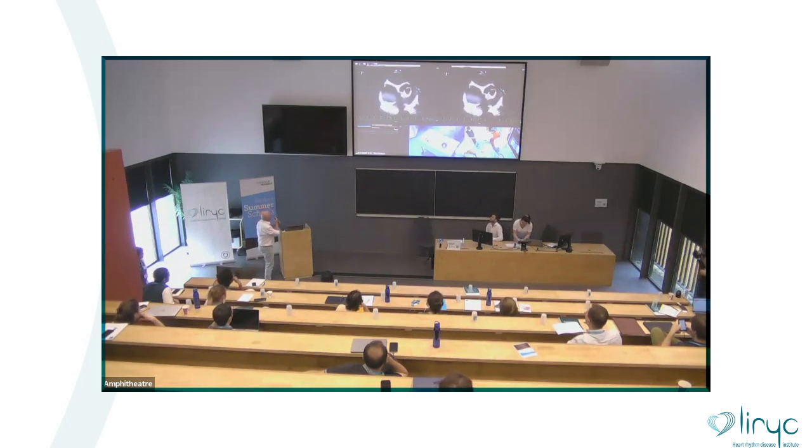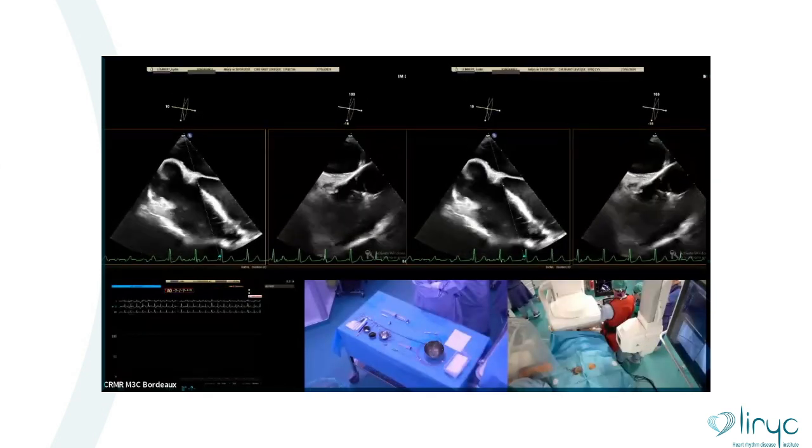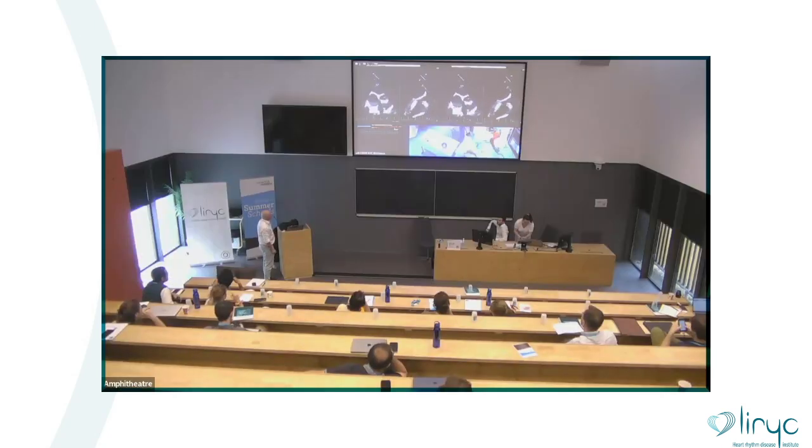Yes. If you go in, yes, there you see the relationship between the commissure and the VSD. Okay. And so what you may not forget is that the cusps come up exactly at the commissure. So that means the distance between the hole and the place that you have for the disc to be placed is much more than the long axis would suggest to you, because they go up. Yeah. And it's very important. I mean, frequently a VSD is associated with an asymmetric aortic valve.